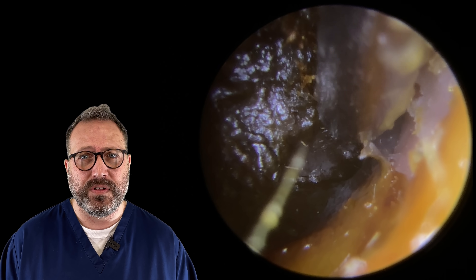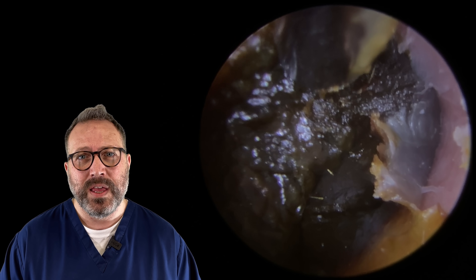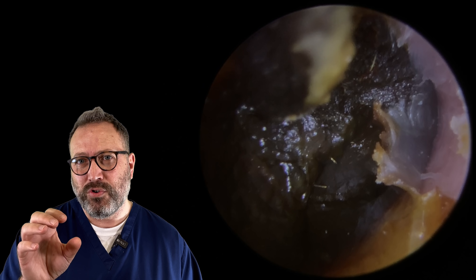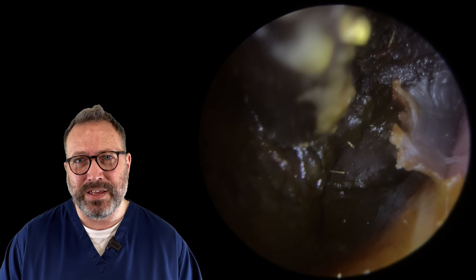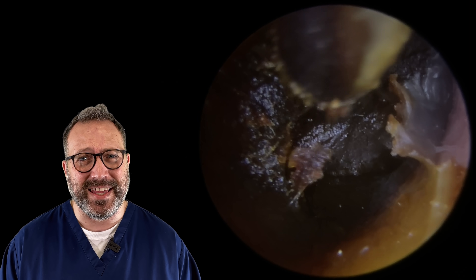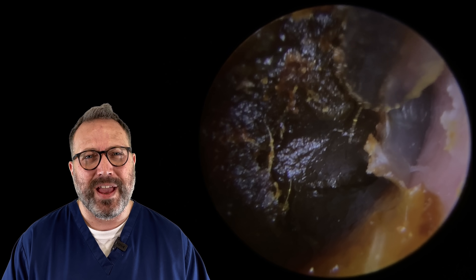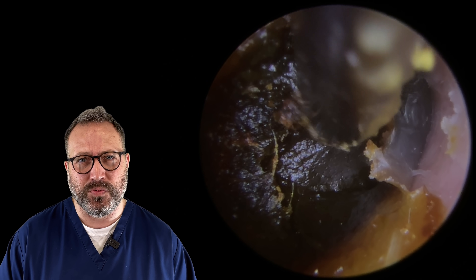I'm just lifting off, slowly peeling this down the canal wall. Now we're just going to do a little bit of gentle probing just before it gets to the eardrum itself. You can see the wax is very, very sticky - as I'm pulling this away it's stretching off the eardrum. Really difficult consistency to work with here.